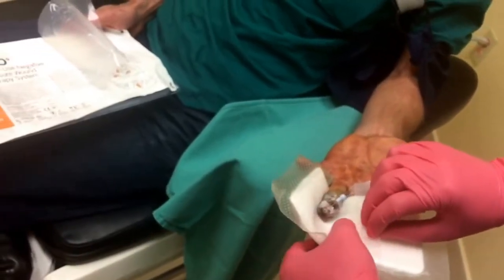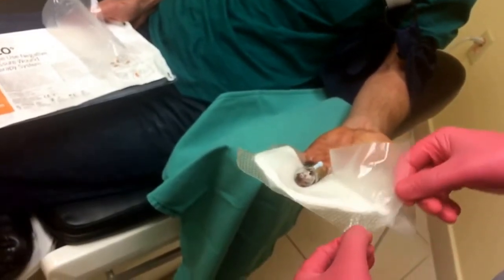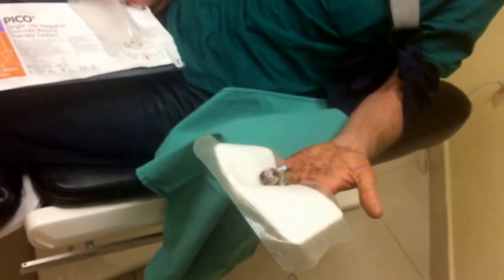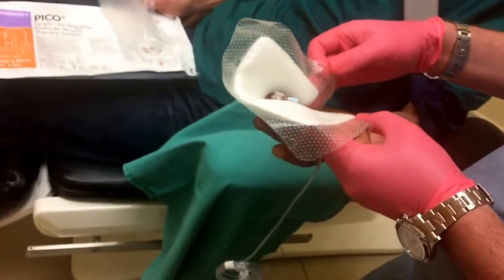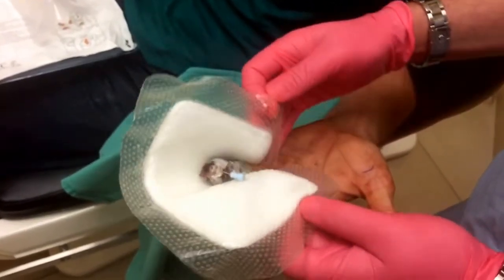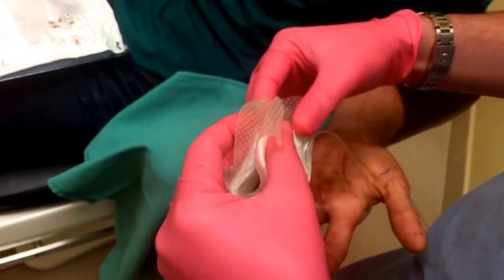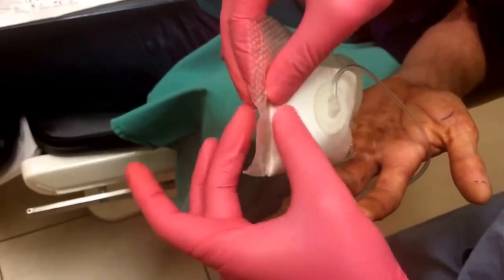What I do is I very carefully remove this sticky layer up here. And then what I do is I want the white to touch — let's see how that white touches. So you want the sticky part. You see how it sticks just like a taco.